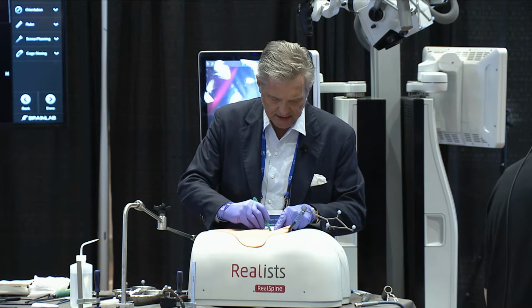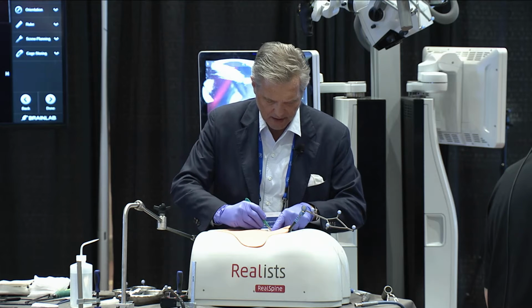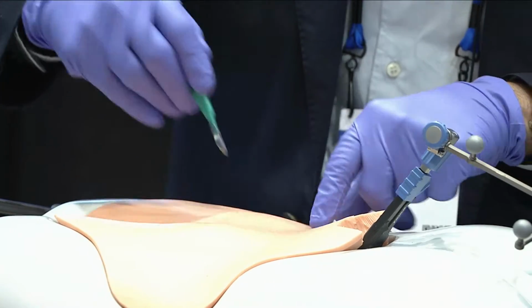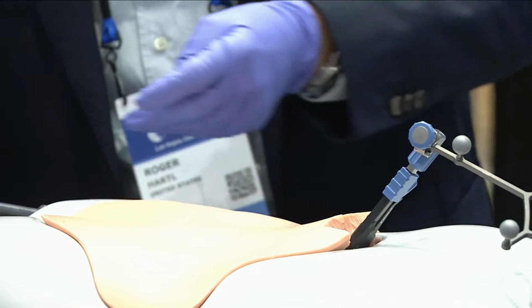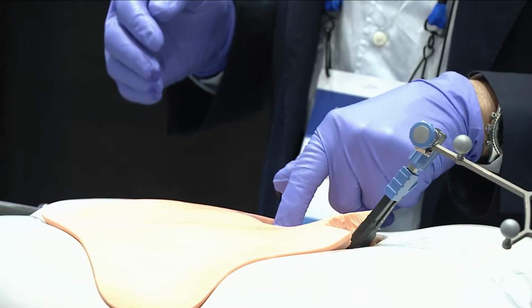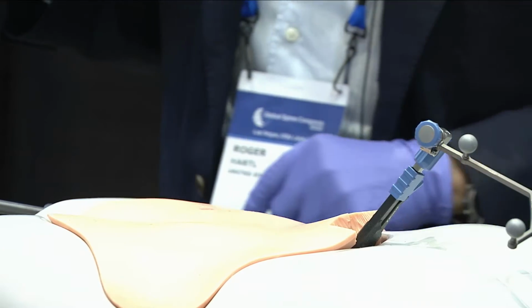So I make a skin incision, maybe a little bit more medial from those 2 dots that I marked, and I make it a little bit bigger than I would in real life because of the plastic model here that's a little bit less malleable than a real patient. So I make the skin incision, I feel for the fascia, I make a fascial incision, and then I look for my entry point.